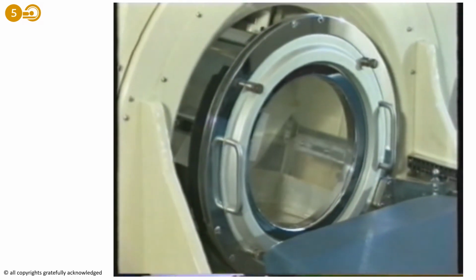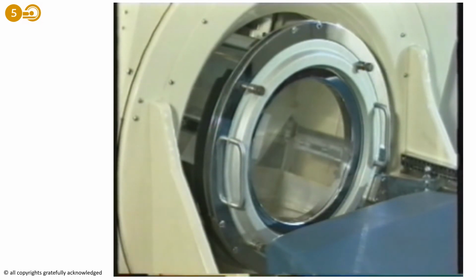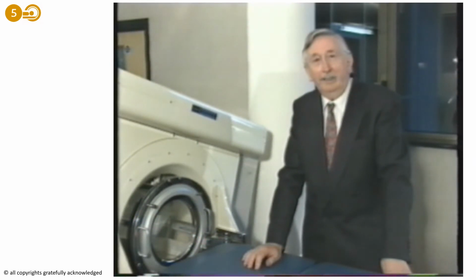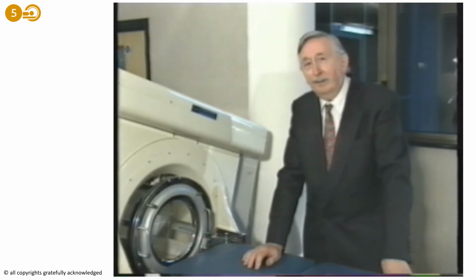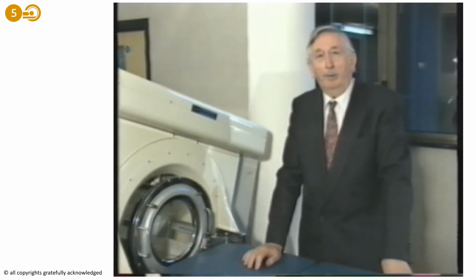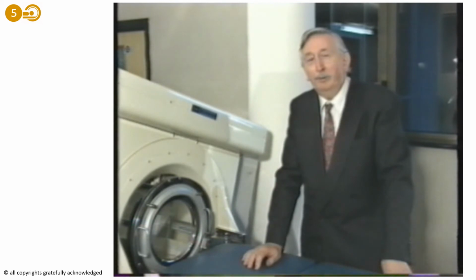The patient put his head in a rubber bag which was surrounded by water. This technique improved the accuracy of the absolute values of density recorded on the picture. It is interesting to note that these absolute values produced by this technique were more accurate than the modern machines, but there were disadvantages, particularly when the water bag burst and threw 2.5 litres of water over the patient. As the machine only had two detectors, it was very slow. It took 2.5 minutes to take two pictures side by side.